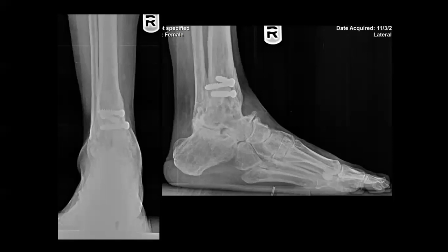Now, I will give you the cheat sheet. She did not have an ankle fusion. So can someone read this AP and lateral for me of this patient? This is almost 35, maybe 40 years post-injury at the time of the surgery. So who wants to take this x-ray and give me a good quick and dirty read of it?